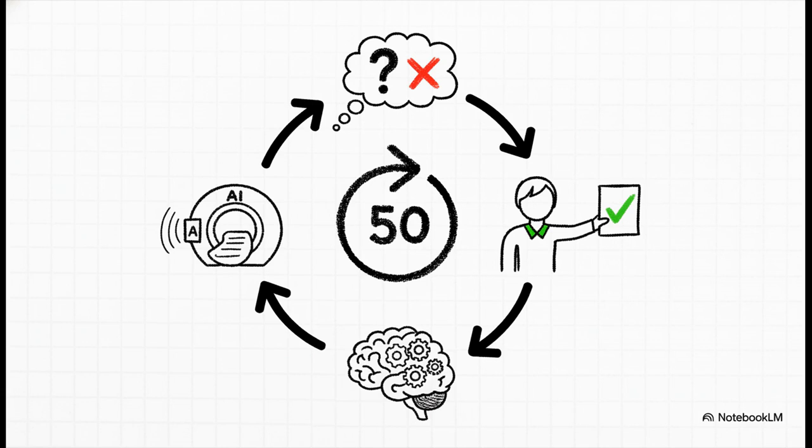Okay, here's how it works. The AI gets shown an image that's already labeled. Let's say it's a glioma tumor. It takes a guess, and at first that guess is totally random and almost certainly wrong. Then it gets corrected. It's told the right answer, and it makes a tiny little adjustment to its internal wiring to try and be a little bit better next time.